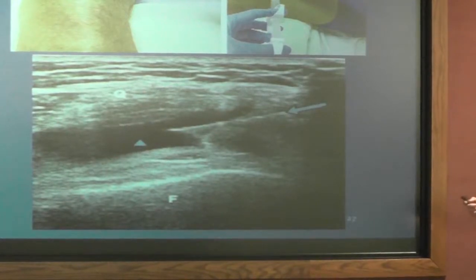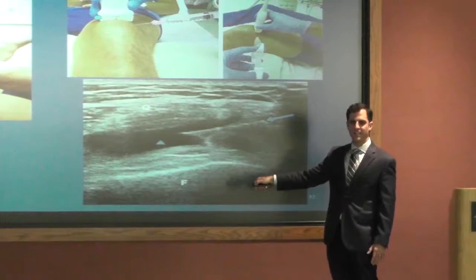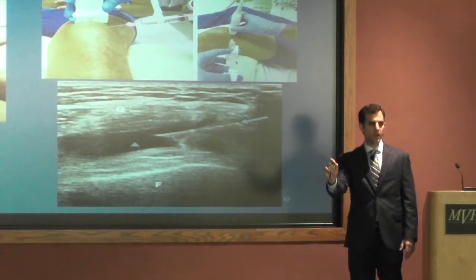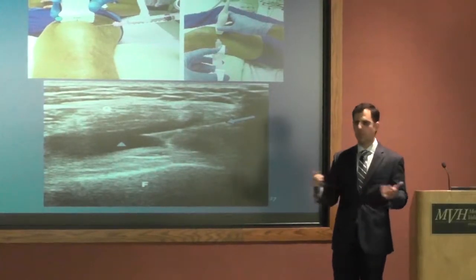So what this does is it increases the accuracy of injections up to 97% by having this visualization of the needle going in. So there's ways to make it much more accurate. If it's a more accurate injection, there's a better chance it works.